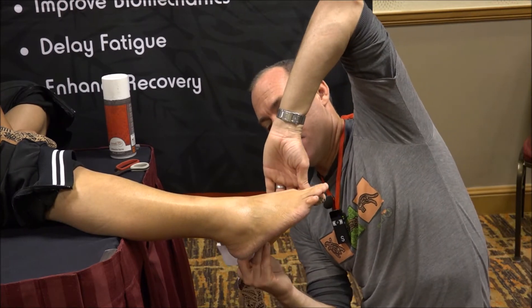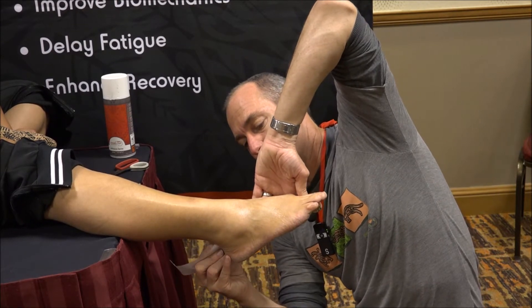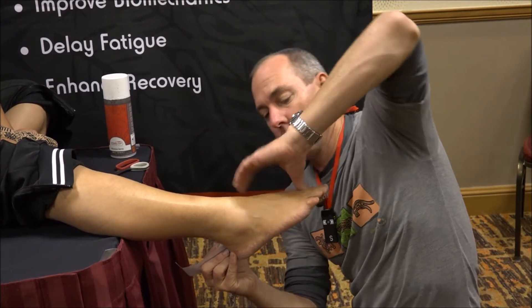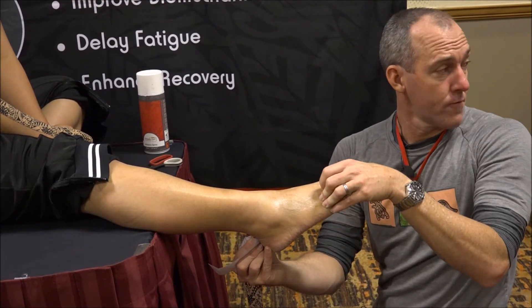Anchor through there with your fingers, and then take up the tension through that medial longitudinal arch and smooth down to the heel. You'll notice I'm in plantar flexion, forefoot adduction, inversion a bit, big toe flexion.